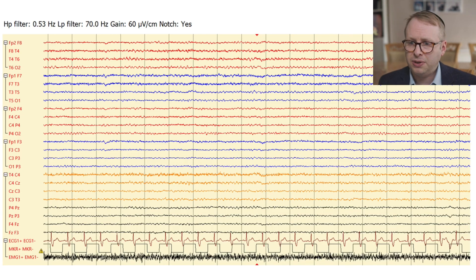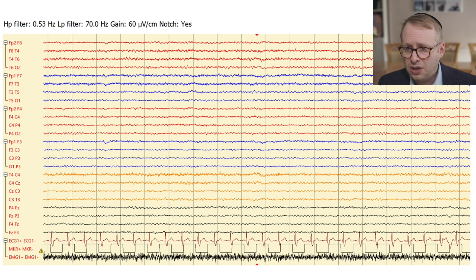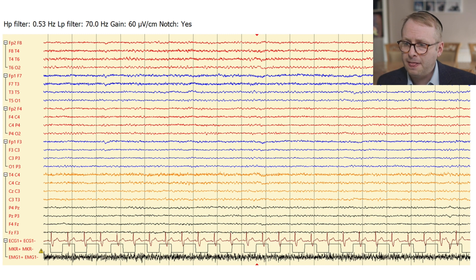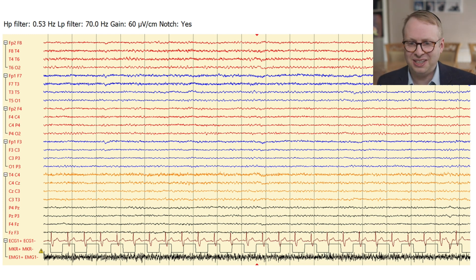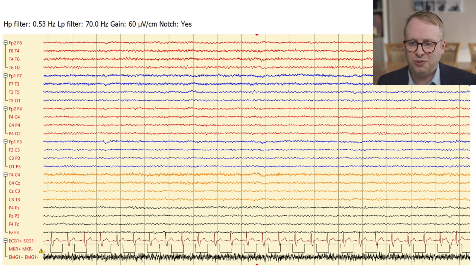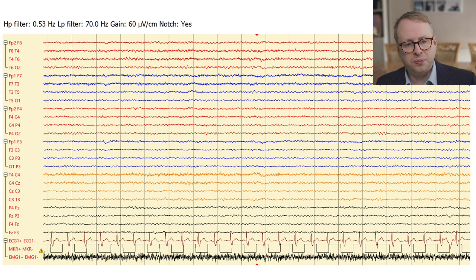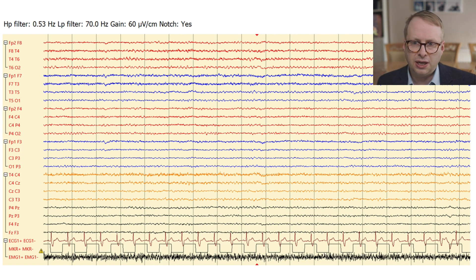Coming back to this EEG which I showed you before, which I would have guessed would have been from someone roughly about the age of 65 or 70 - actually this particular person is way past 100. And you can see quite nicely that you can have very well-formed alpha rhythms with only some occasional underlying slowing, even in the advanced extremities of age.